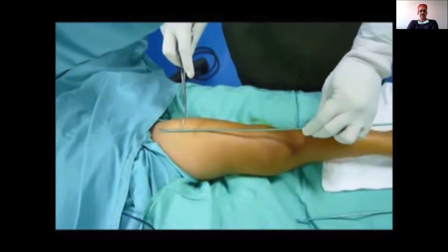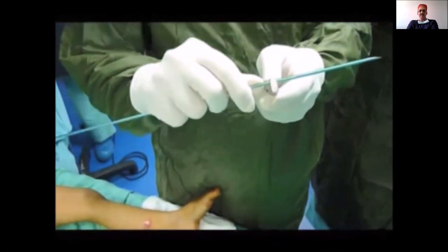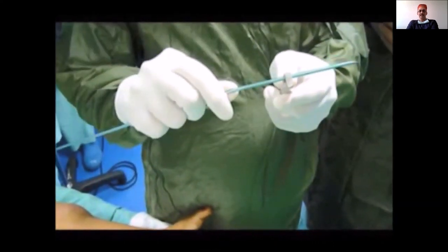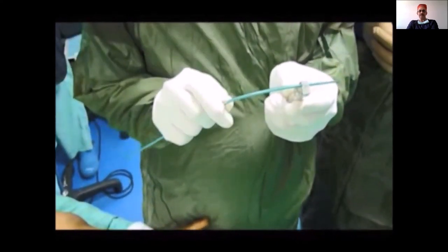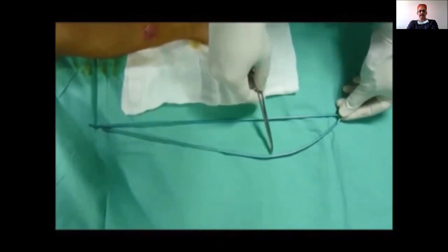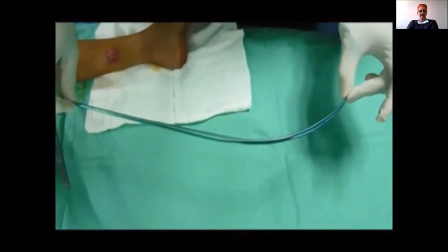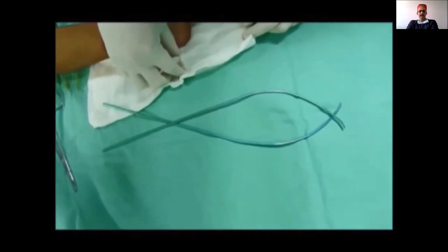As seen in this video, I am placing the nails on the shaft — that is the perfect amount of canal fill I want. Then I need to bend the nail. With an artery forcep from the seating point at the intertrochanteric line, I choose where my apex of the bend should be and bend the nail along the curve of the hockey stick. I bend gradually on either side of the apex. The height of the bend on both sides should be three times the canal diameter — for example, for an 8 mm canal, the height should be 24 mm. Bend both nails symmetrically so they match and form a perfect spindle when inserted.